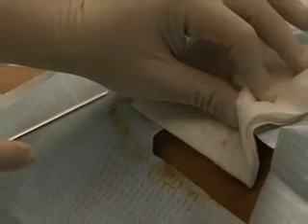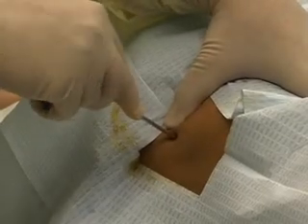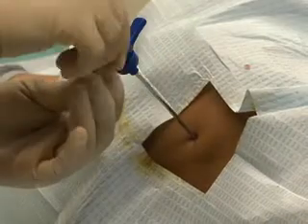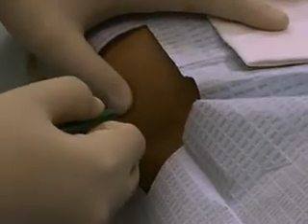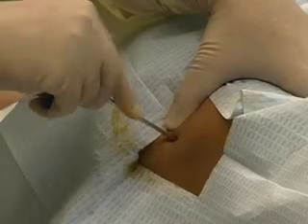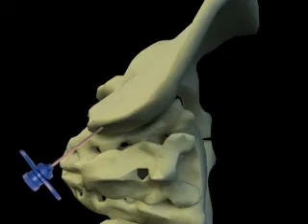A bone marrow biopsy is often done following a bone marrow aspiration. Maintaining sterility, obtain a bone marrow biopsy needle. Holding the needle between your palm and index finger, insert the needle into the patient's skin and advance until it touches bone. If an aspirate has been performed, the same entry site through the skin may be used for the biopsy. However, a skin incision may be indicated if only a bone marrow biopsy is being done, or after an aspirate to allow for entry of the larger biopsy needle. While applying steady pressure, advance the needle with its stylet in place into the cortex by rotating back and forth. The biopsy needle should be inserted into bone at a slightly different angle than a previously performed aspiration.